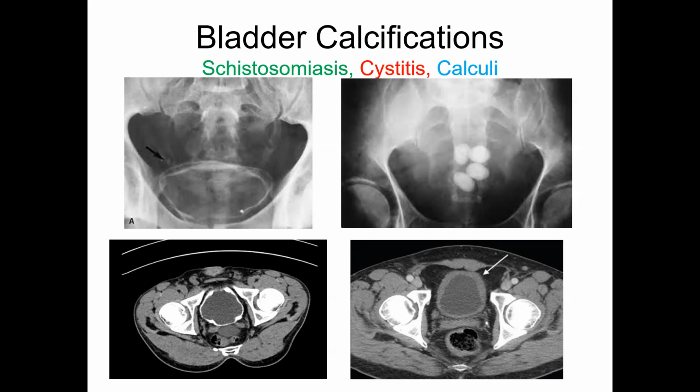In adults, in males, it's going to be in the later age when there is prostatitis and hyperplasia of the prostate. They then have retention of urine and then they have recurrent infections. Okay, so cystitis in females is more common in the early age, whereas in males, you have cystitis in the later age. Clear on this? So this is how cystitis would look like on CT. You would have a thick wall. Even if you do an ultrasound, you see that the wall thickness is more than 3 or 4 millimeters.